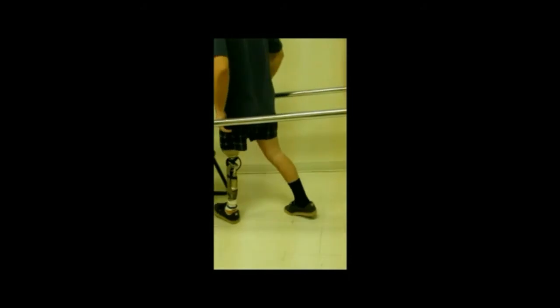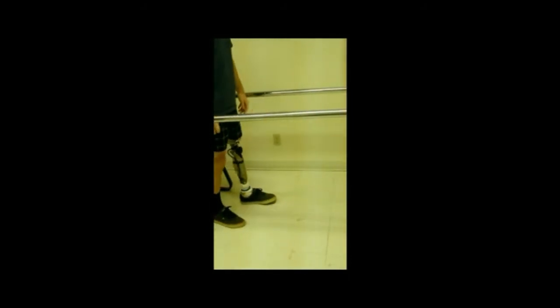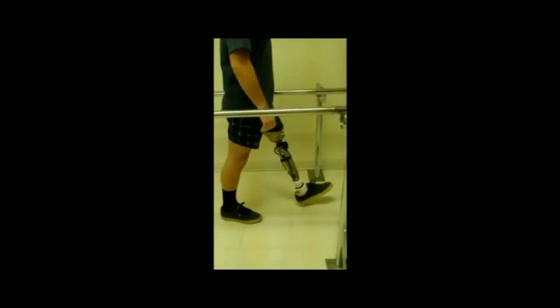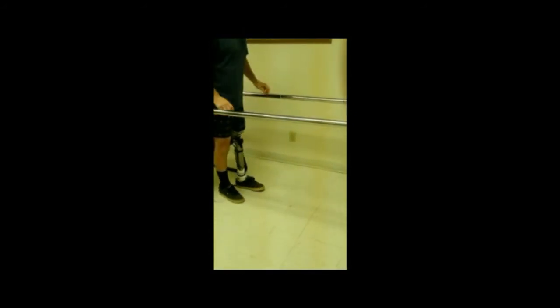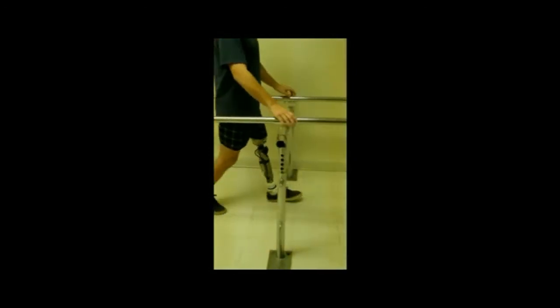At the moment, it's pretty equal. And it's really way down, so we don't have to worry about it. It doesn't have any terminal impact. And so I'm not going to make any adjustments. I'm going to let him get used to using the leg. I didn't tell him to, but he's all of a sudden walking without his hands, which is in a test socket. So it's okay. But that means he's loading the socket. He's getting a very equal gait.